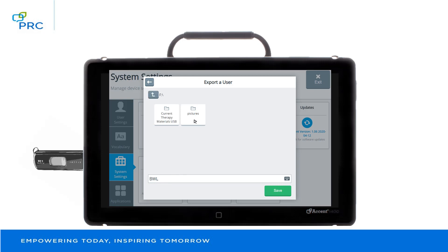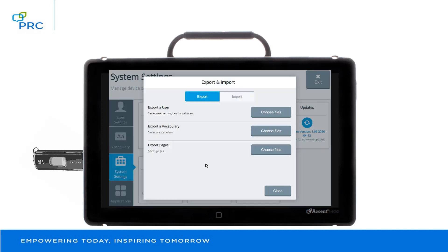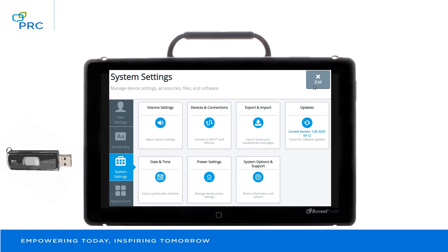Here's my flash drive. I want to save and it's exporting my user. I know that it's done because I get that little screen that says it's complete and then I close. At this point, my user area has been saved on my flash drive. I can remove it from the device and return to my vocabulary.